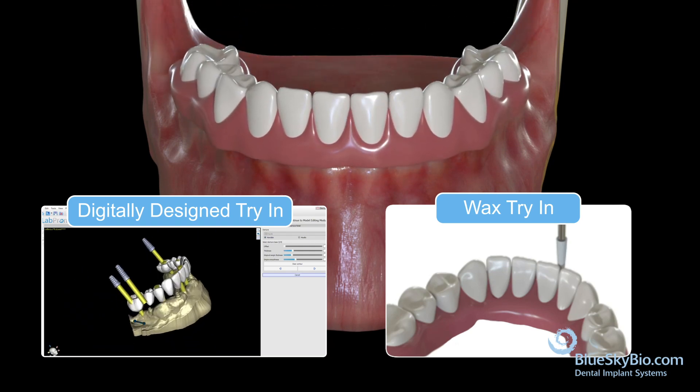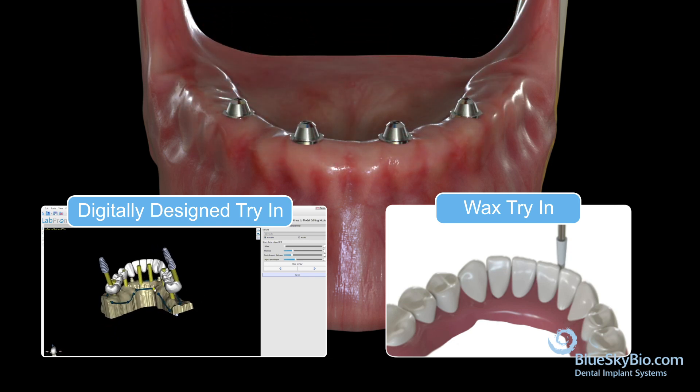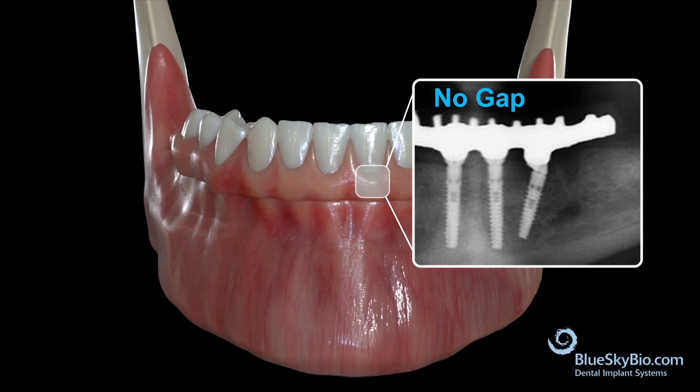The lab will then send an aesthetic try-in of the restoration. Place it in the mouth and evaluate the aesthetics and the bite. Any changes that need to be made should be done at this stage. Once the try-in has been approved, send it back to the lab for final fabrication of the restoration.